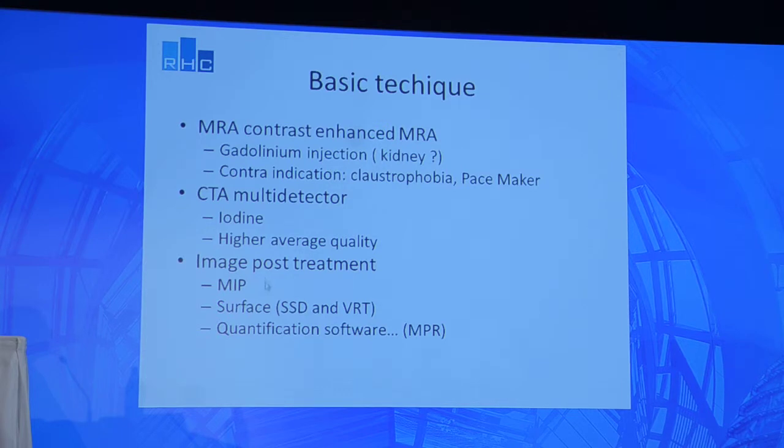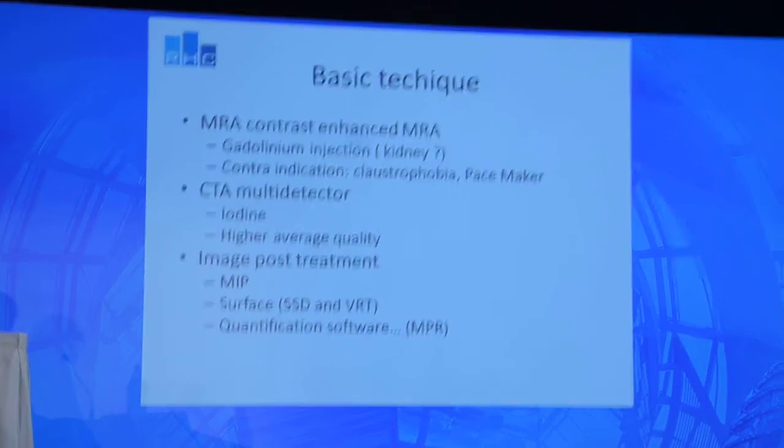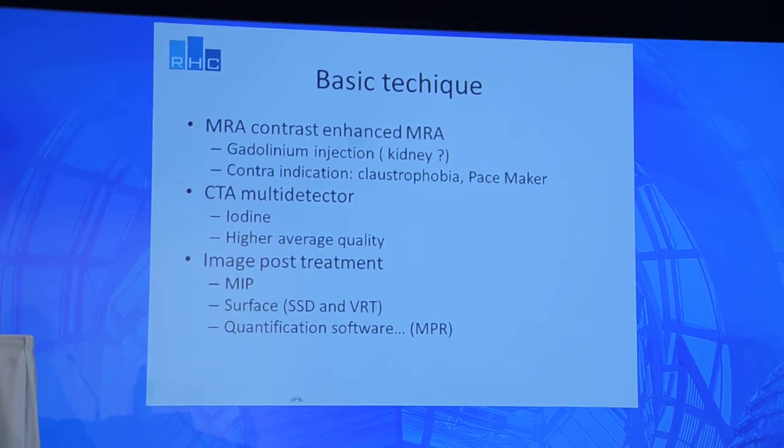Different techniques with these strange words that you know about: MIP, surface rendering technique, surface shaded display, and volume rendering technique, which are good to see and good for the display, not necessarily very good to calculate the stenosis, and a different kind of quantification software, most of them using multiplanar reformation.